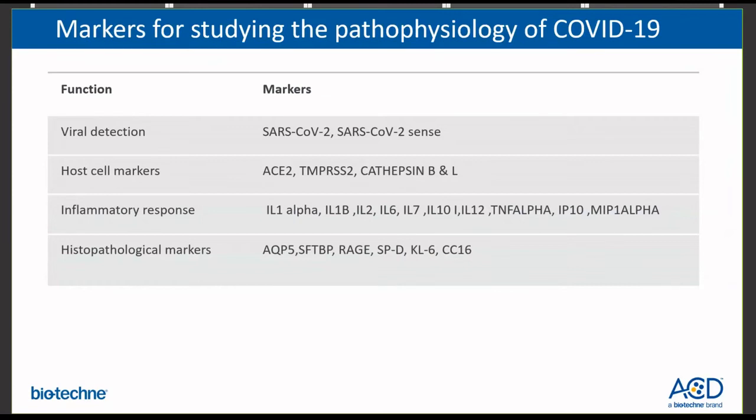In addition, like I mentioned, the cytokine storm. These are inflammatory response markers that were shown to be infiltrated early, and were shown in the lung tissue of patients with a severe form of the infection and patients that showed signs of acute respiratory distress syndrome, or ARDS. Using RNAscope, you can really spatially visualize all of these immune markers, allowing you to identify the immune landscape at the site of infection.